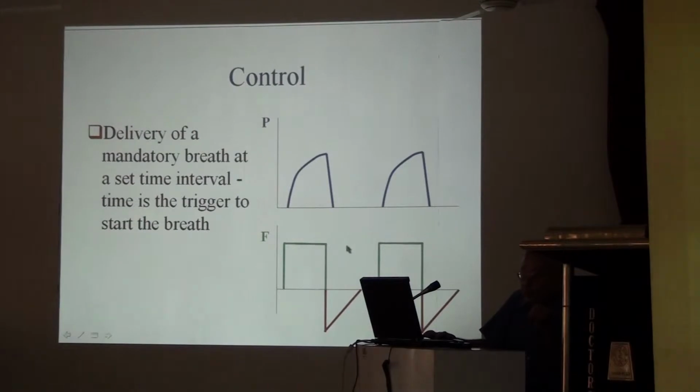If you have a flow sensor, you can immediately see this air coming out of the patient's lung and gradually the velocity is decreasing. Initial velocity is very high because it follows the starting slope. If the stretching is more, the contraction will be more.